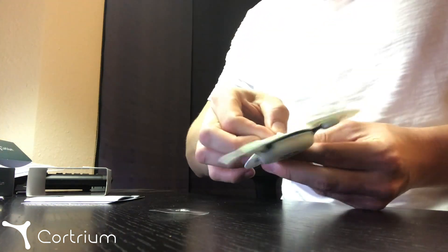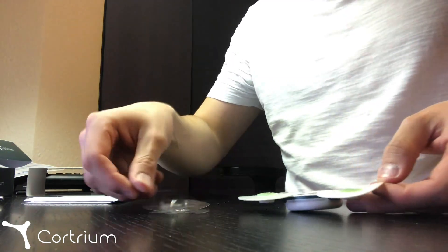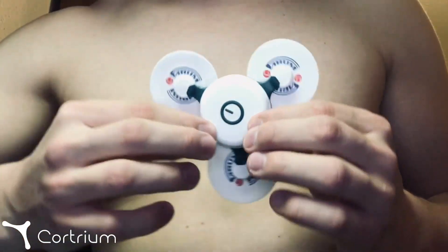Turn the device and attach three electrodes to each of the electrode connectors. Carefully remove the plastic from the adhesive surface of the electrodes. Then attach the device to your chest, turning it so that the small green line on the device is pointing upwards.